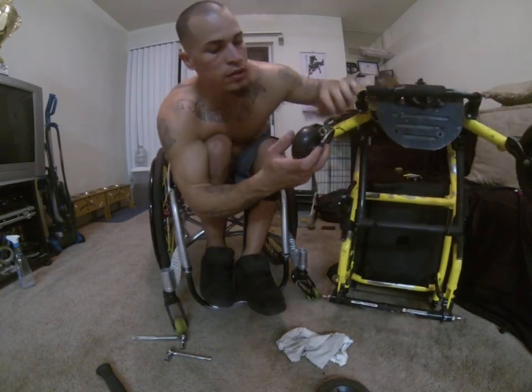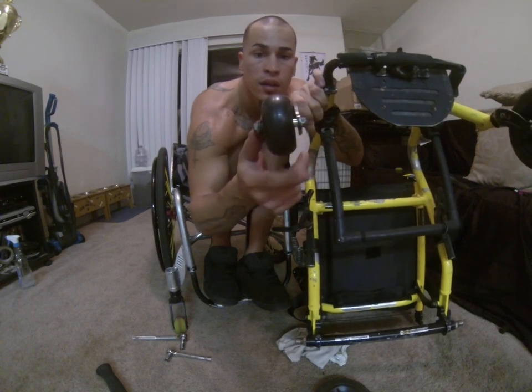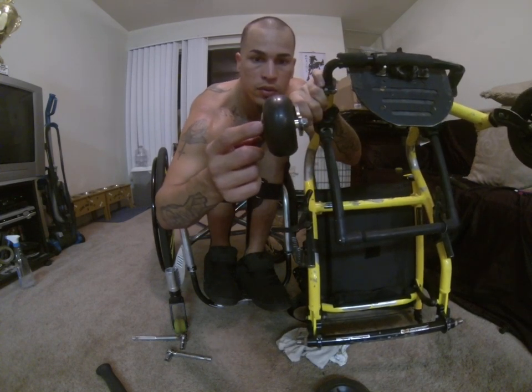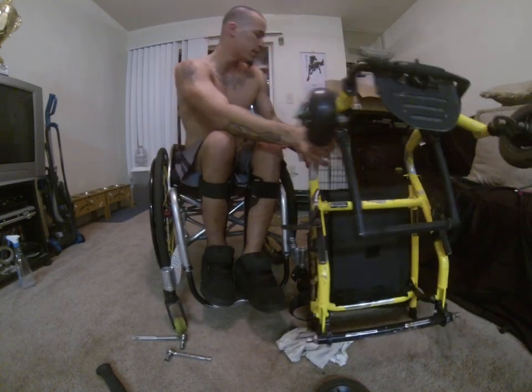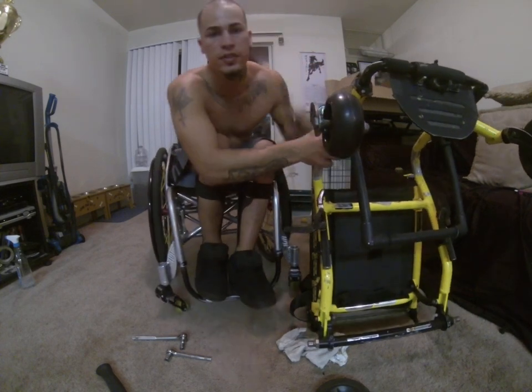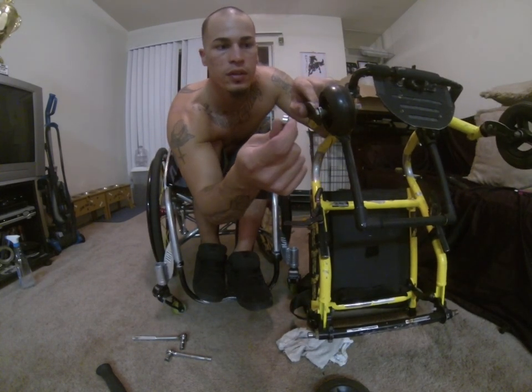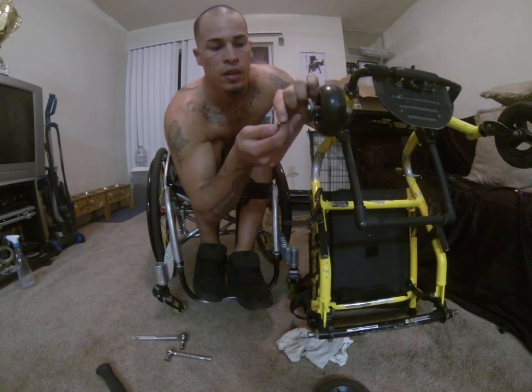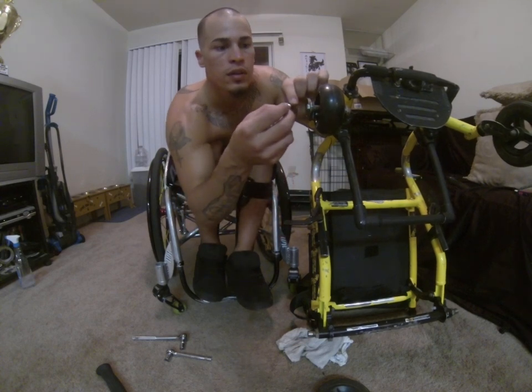So also, if you see the little spacers are too wide, if they're too wide, you can go to your local hardware store and you can find smaller ones like these. They come in different sizes. This is thinner than the one that's in there. That one's a little thicker, this one's a little thinner. And you see the size difference.